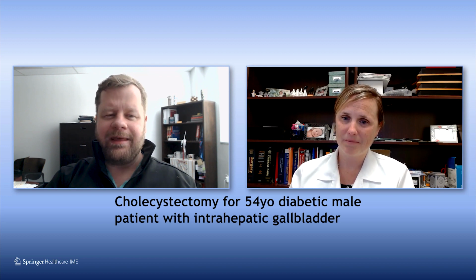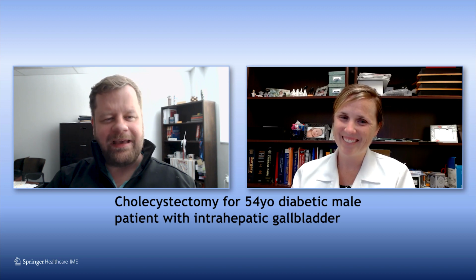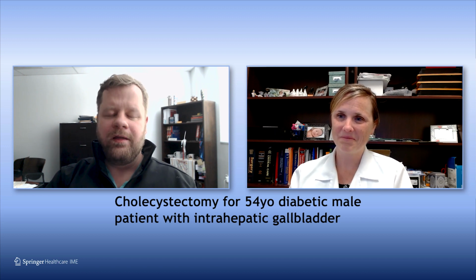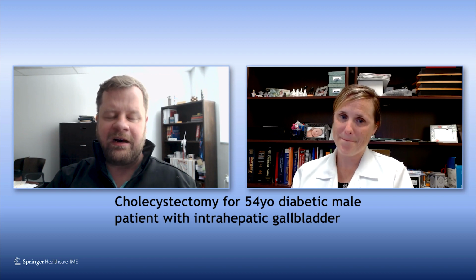I'll start by dividing it into reality and then ideally what would happen. Ideally, the cautery would take care of the surgical bleeding there. You've clipped your cystic artery. Maybe you've valsalvaed to make sure that the clips are in place and nothing is coming off and everything looks great. And then you ask for a topical hemostatic agent, whether that is a flowable or some Surgicel, to lay nicely in the gallbladder fossa. And then you pat the liver down and the patient wakes up and everybody goes on about their business.